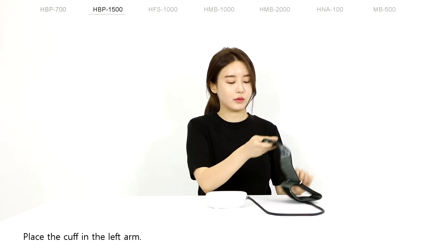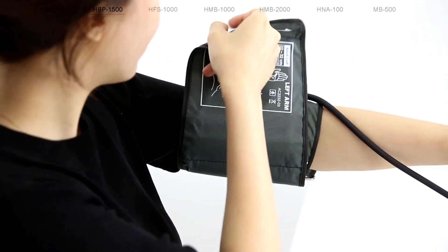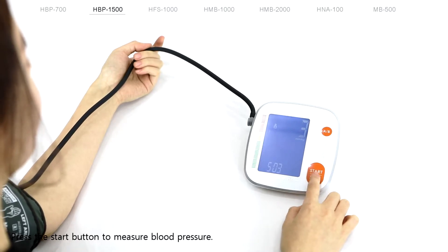Place the cuff on the left arm. Press the start button to measure blood pressure.